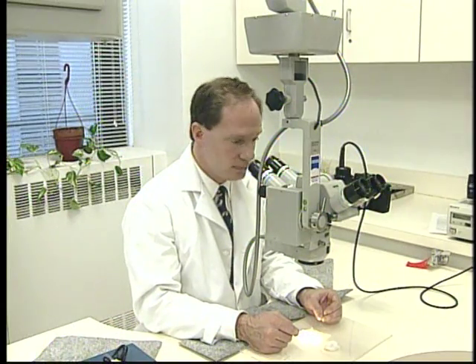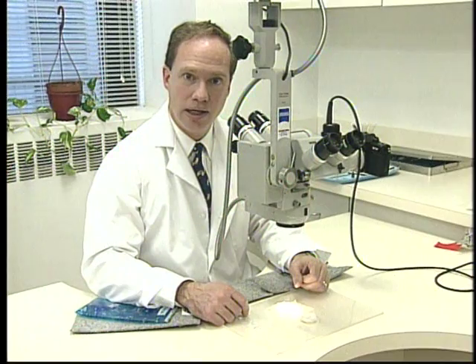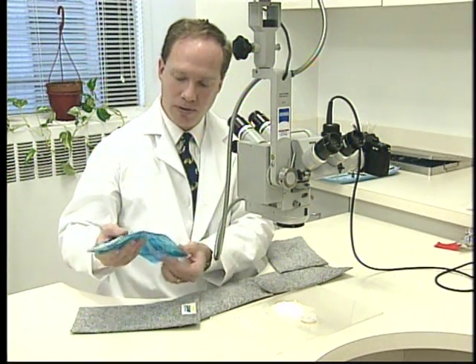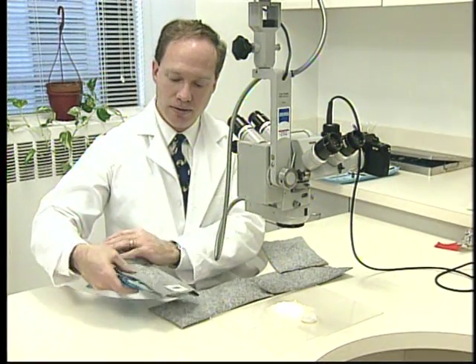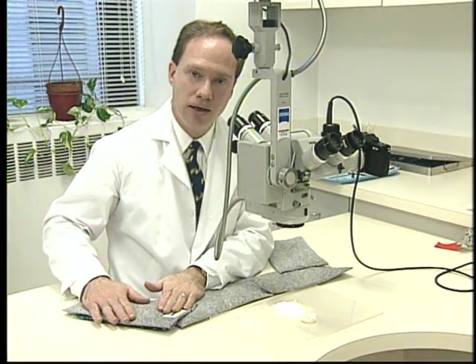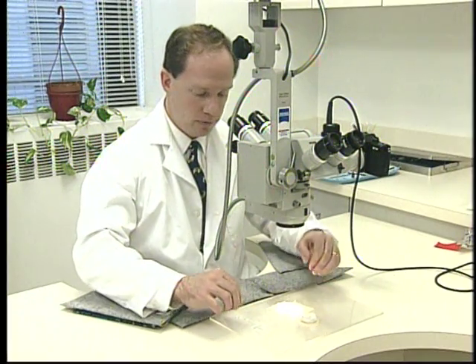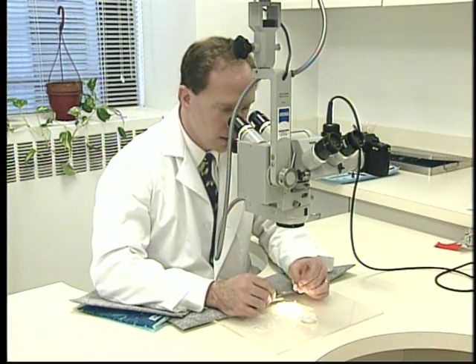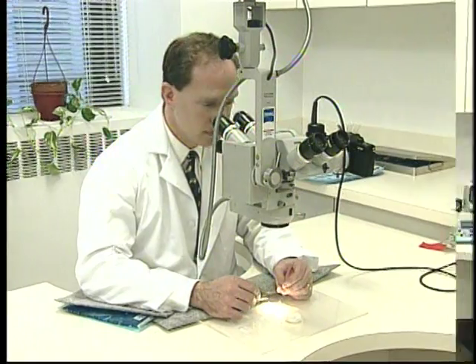An additional point about microsurgical ergonomics that our laboratory director, Yelena Akalina, has come up with is the use of one of these cold hot packs placed in a soft bag, or you can use bags of IV solution or just folded towels to rest your forearms and elbows comfortably, as well as your wrists, so that you are totally comfortably positioned for microsurgical technique.